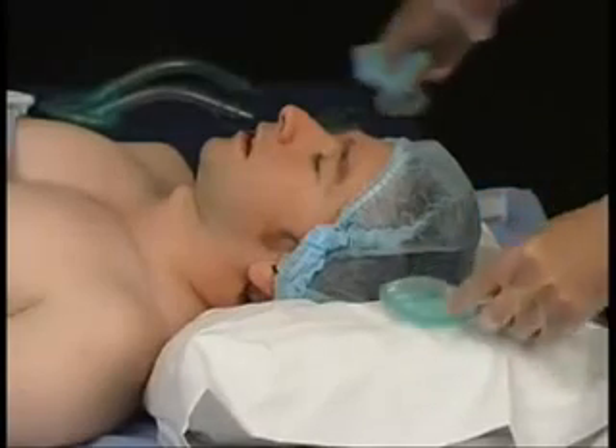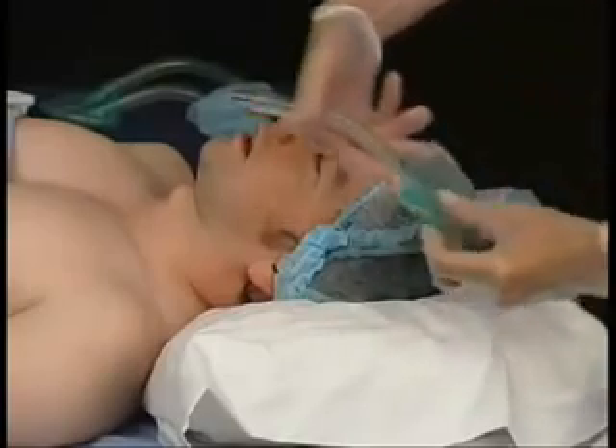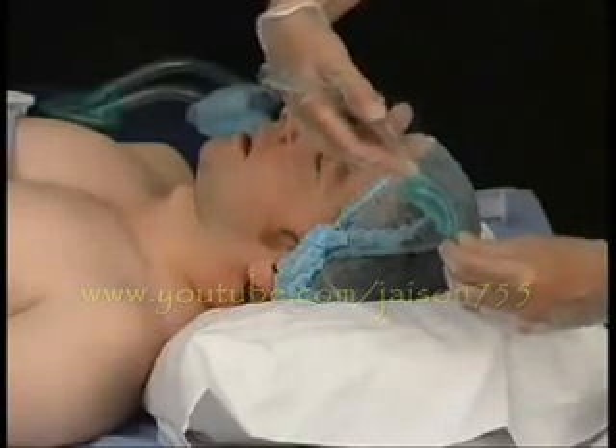Then, in readiness for the correct insertion technique, insert your index finger into the slot formed behind the flattened cuff and the junction with the airway tube.